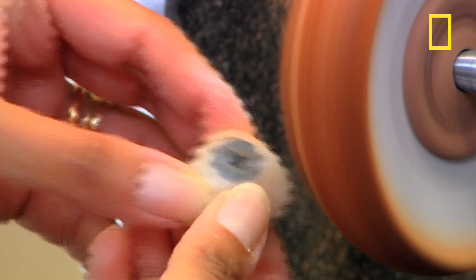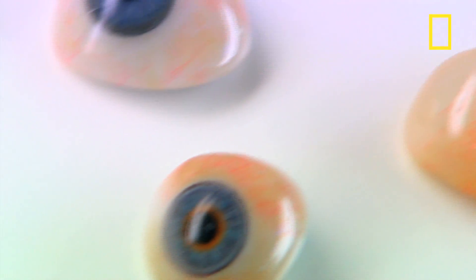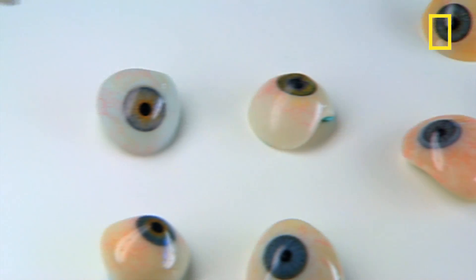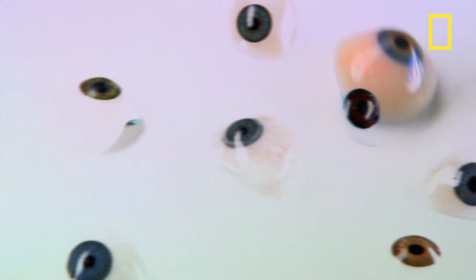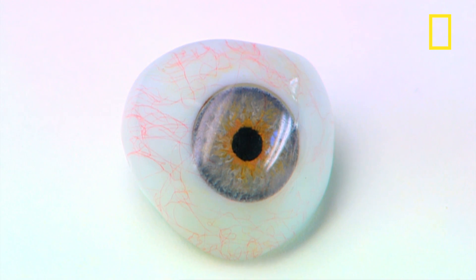Finally a buff and polish gives it a nice glossy finish and the appearance of a living eye. The expected lifespan of an artificial eye is around six years as long as it gets looked after properly. And the end result is pretty amazing — meet Pavel. He's been wearing an artificial eye since an accident when he was 15.